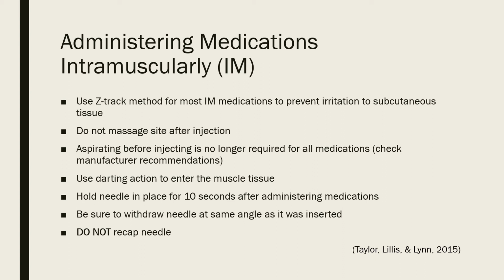You want to hold the needle in place for at least 10 seconds after you've given the medication to make sure that the medication has dissipated into the muscle, and withdraw the needle at the same angle as it was inserted so that you don't damage the muscle. And you never want to recap the needle. We will teach you how to dispose of those needles safely.